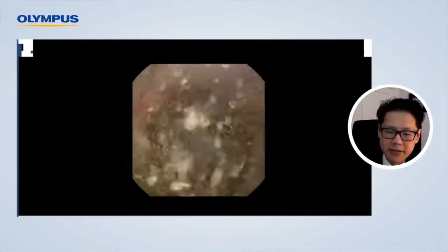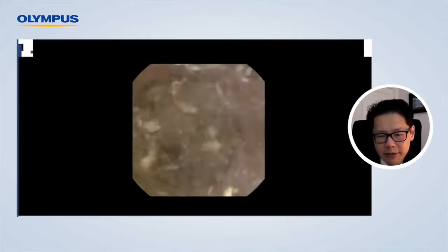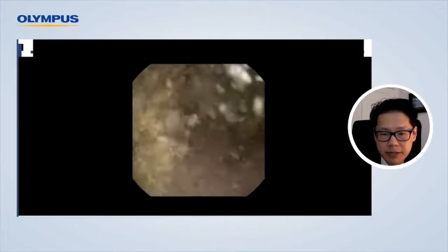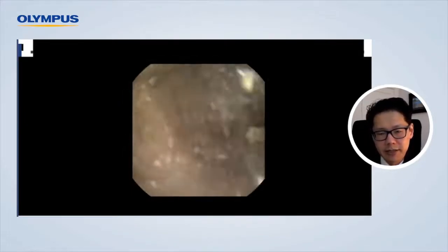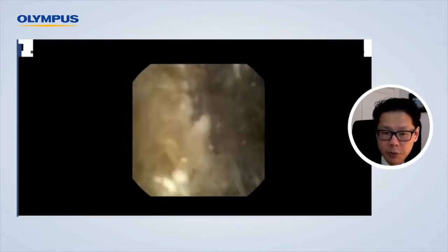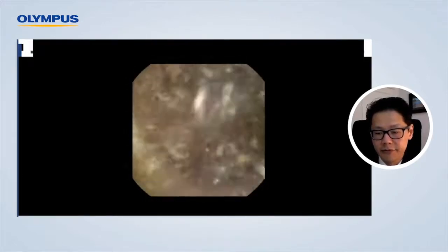And all you need to do is sit the fiber in the middle of a calyx, and then it will break up really nicely. Now, you'll see here that I've actually hit the back of a calyx accidentally, and this often happens even with holmium YAG laser. And when that does happen, you'll often find that you'll get some bleeding. But with the thulium laser, because of the wavelength, it actually coagulates very nicely and you don't get bleeding. With the holmium YAG laser, if you do get some bleeding during your case, it can actually affect everything. And then it's very difficult to see and the chip on your scope gets saturated and it can often be difficult to finish the case. And you can see here, there's very, very fine silt and very fine dust.